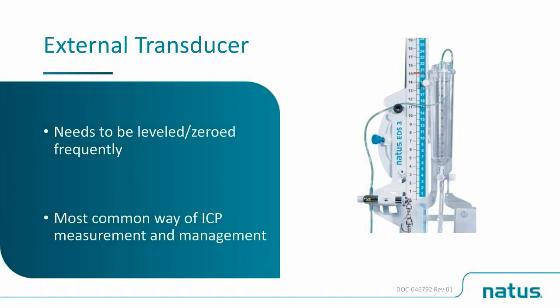I know you've now heard me say the word drift over and over again, and you may be asking yourself, what is this lady talking about when she says drift? When you think about drift, I want you to think about your transducer slowly becoming inaccurate. Because external transducers drift more quickly, meaning over hours instead of days, we have to re-zero them often to maintain accuracy. The same applies to patient positioning.